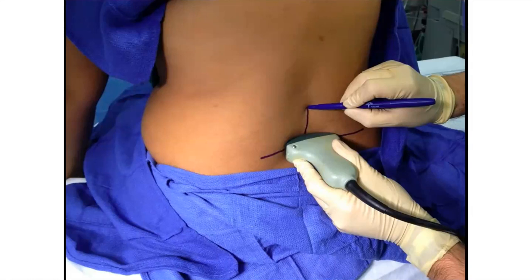It has been described to do it concurrently, which is referred to as ultrasound-guided neuraxial blockade. But this is a more experimental technique and is considered even more difficult. And sometimes the difficulty even comes in with the fact that you need more than one operator to achieve this.